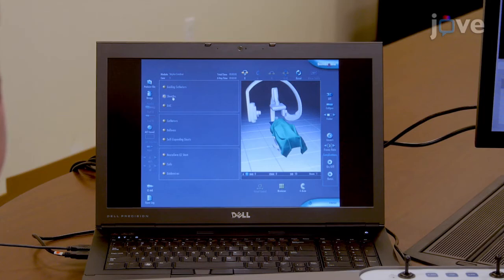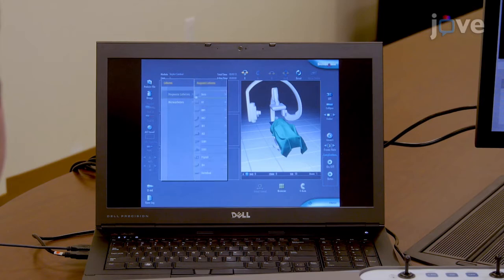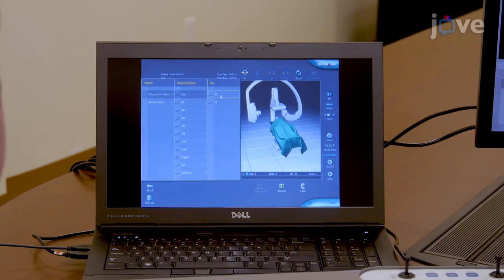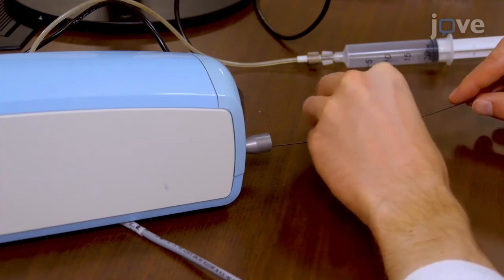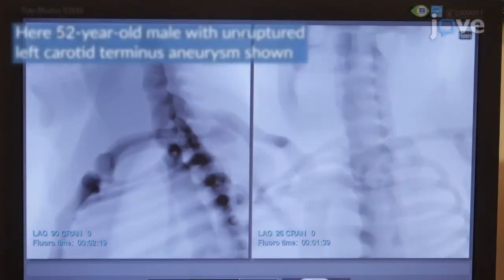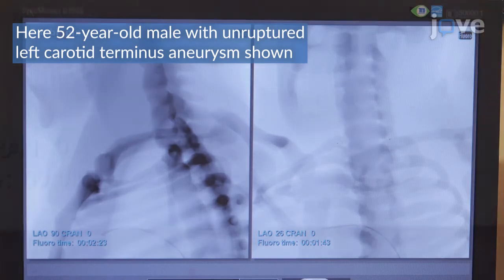For a four-vessel cerebral angiogram simulation, select a five French femoral sheath, a 0.035-inch guide wire, and a five French diagnostic catheter from the drop-down menu as tools to be used in this simulation. Insert the guide wire into the simulator machine until it registers on the simulation screen, signaling that access has been gained. Advance the guide wire until it is visualized in the descending thoracic aorta and continues into the aortic arch.